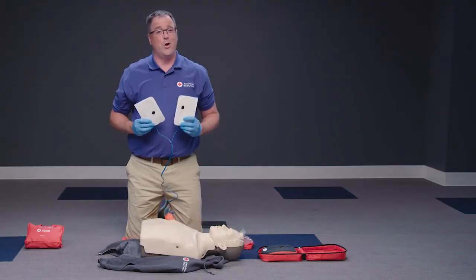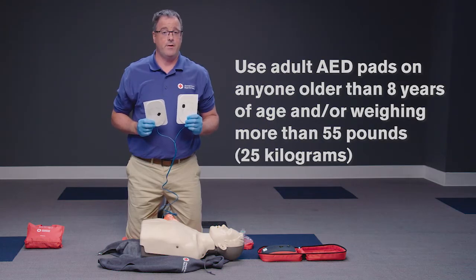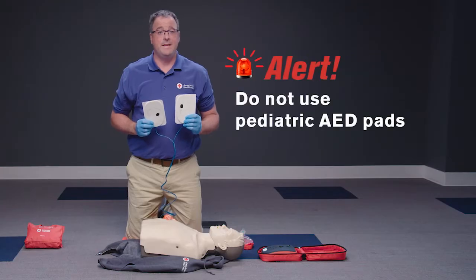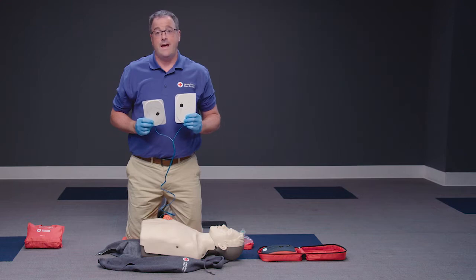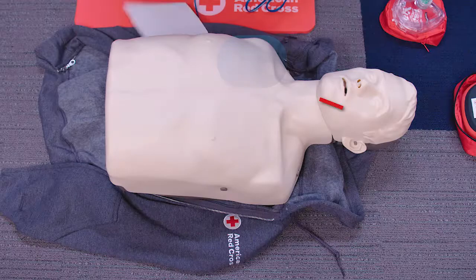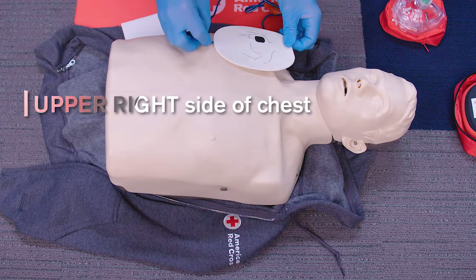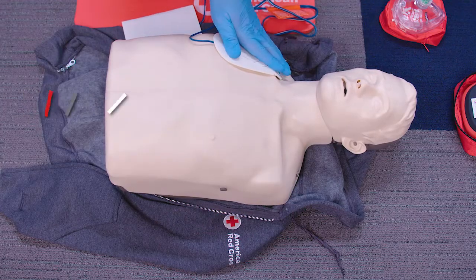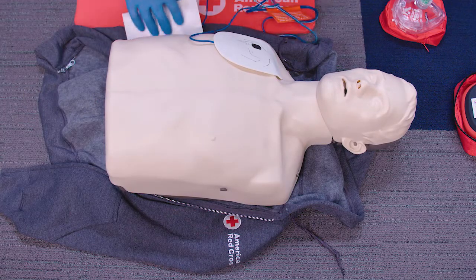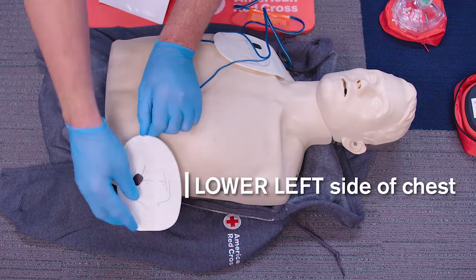First, always use adult AED pads on anyone older than 8 years of age and/or weighing more than 55 pounds or 25 kilograms. Do not use pediatric AED pads, because the shock delivered will not be sufficient. Then, place one pad on the upper right side of the chest and the other on the lower left side of the chest, a few inches below the left armpit.